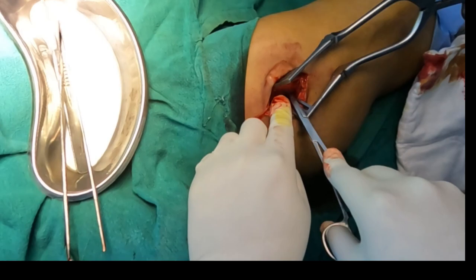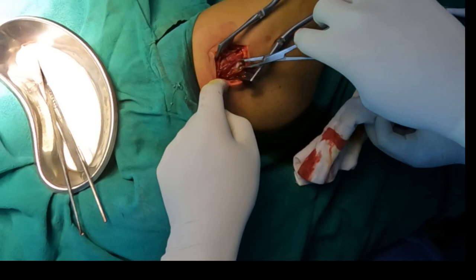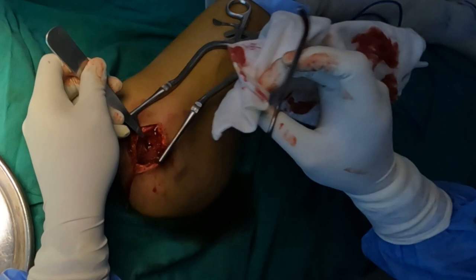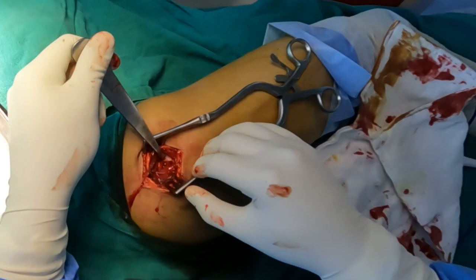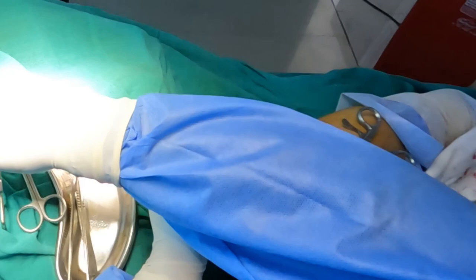Now the underlying hip abductors can be seen. I am putting a small curved artery forceps into the hip abductor and trying to open it at the tip of the K nail. Once I open it, I am putting a small bone lever across the tip of the K nail and with the help of a cautery I will try to remove the soft tissue around the K nail. Here you can see the tip of the K nail, and I am using a small artery forceps to clean the soft tissue around it.